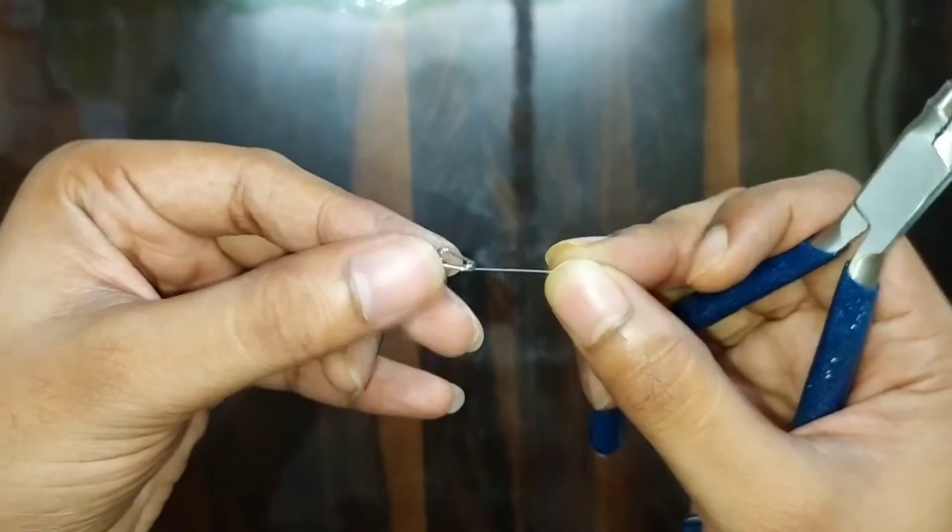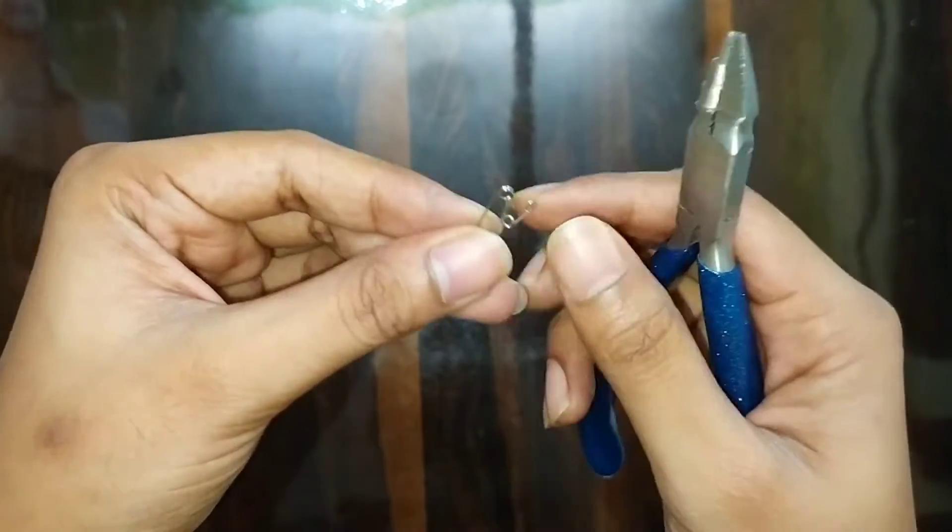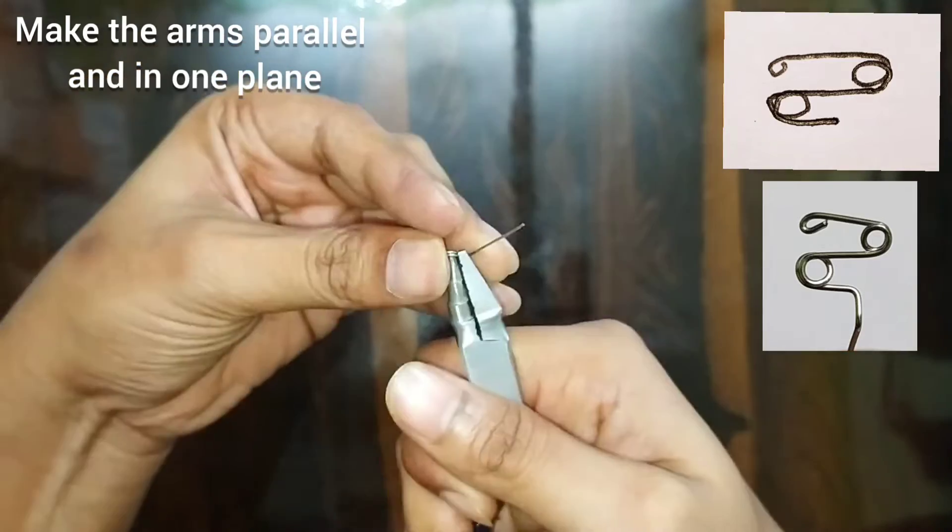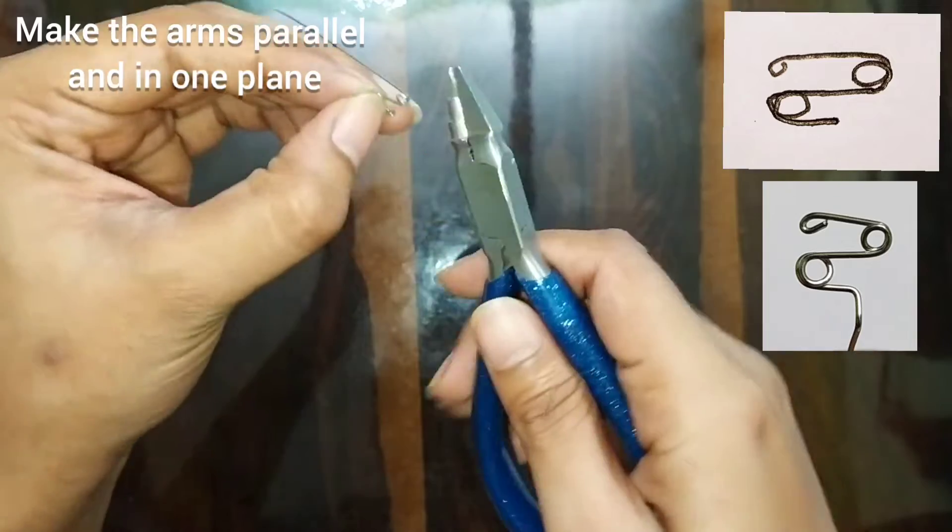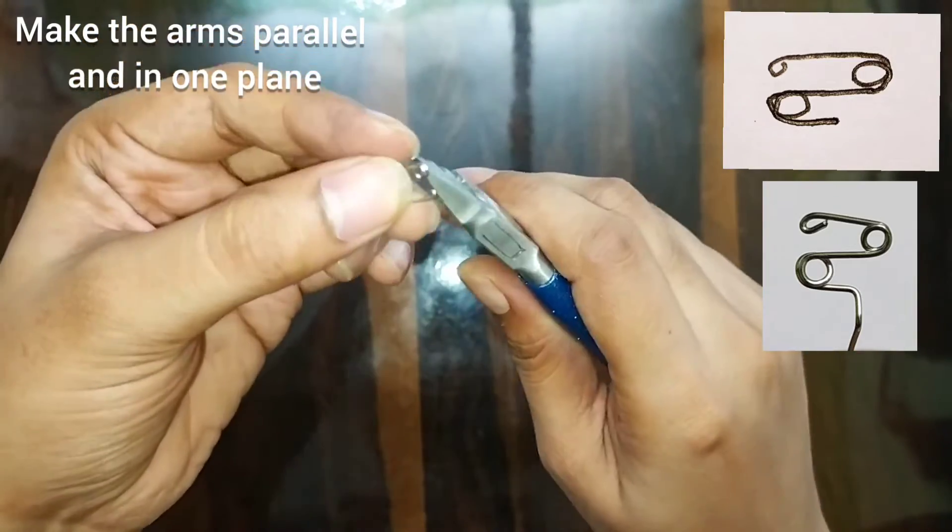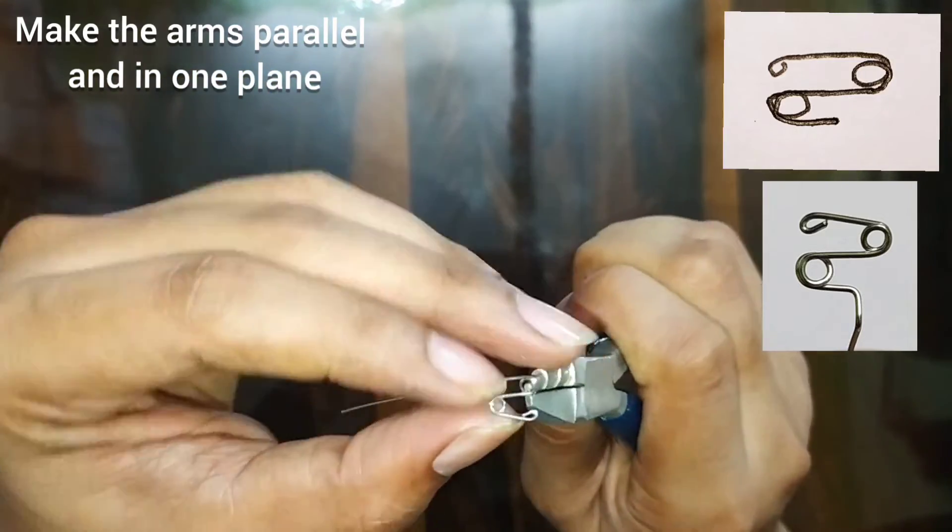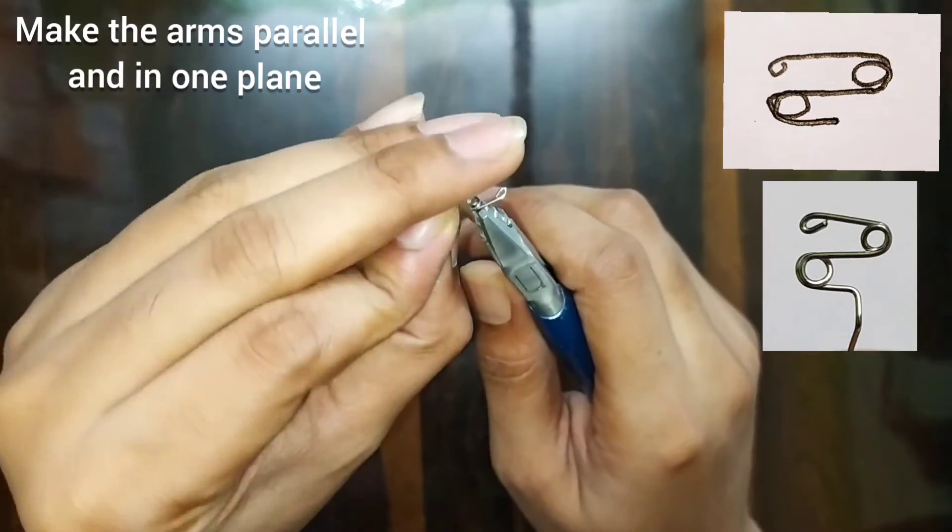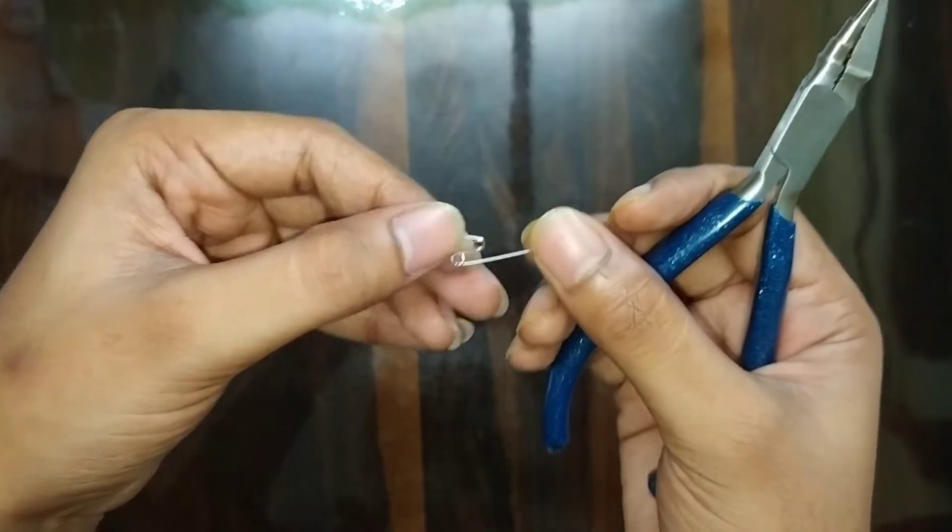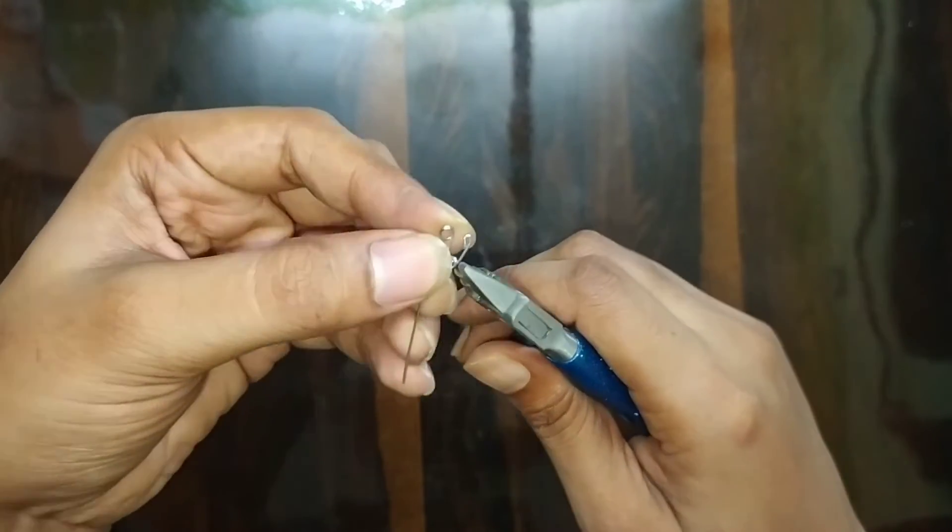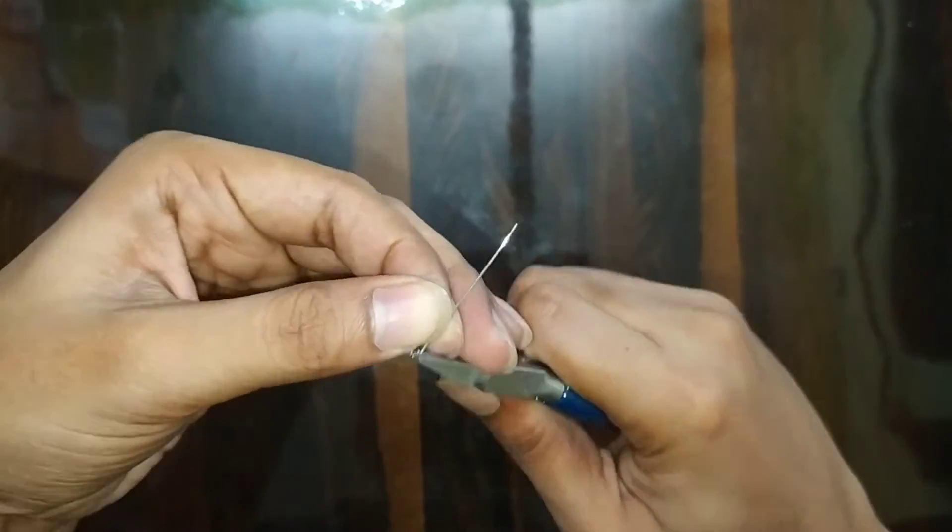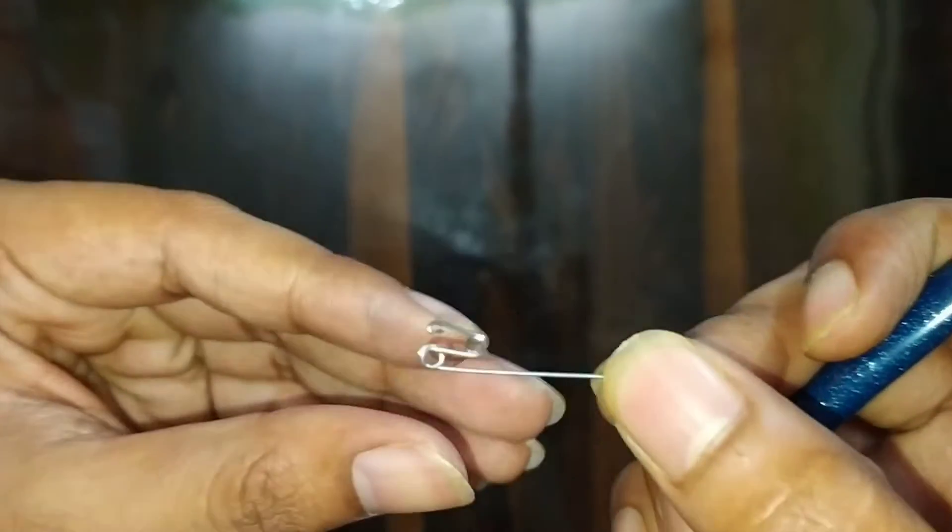Here we will do some minor corrections and try to make it in the plane. Make the arms parallel to each other. You can check here how it is looking.